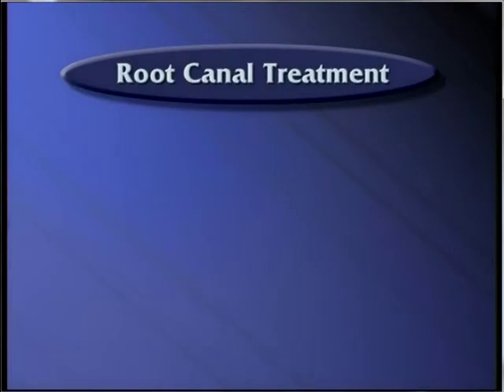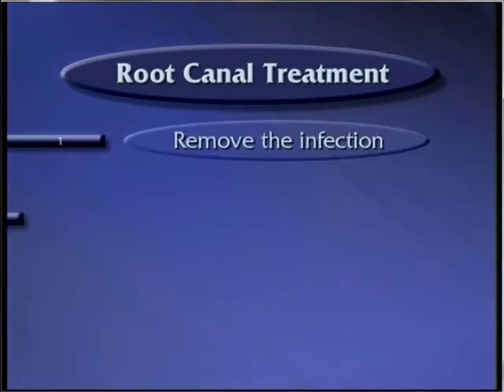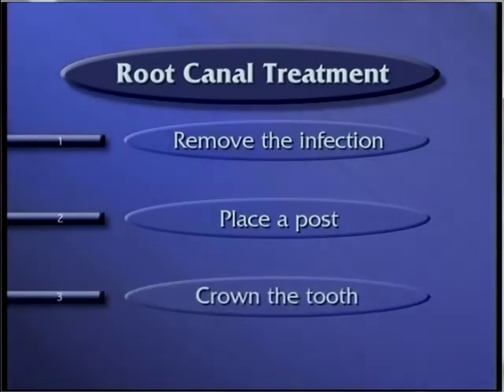Root canal treatment and restoring the tooth usually involves 3 steps. First, we remove the infection to promote healing. Next, we place a post to strengthen the tooth, and then we crown the tooth to protect it.